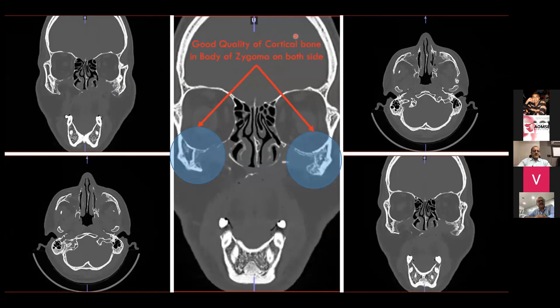Now, when you plan the patient-specific implant, you need to understand this concept of virtual planning, because in virtual planning you can create n number of designs. You can put a titanium design on the cranial cavity. You can put one on a nasal bone. You can, but that has to convert into a clinical scenario.